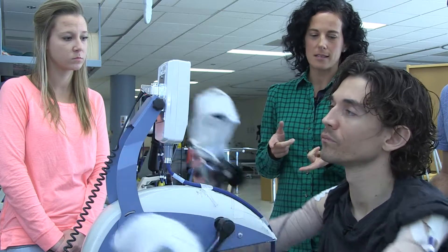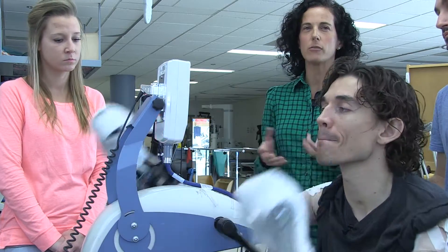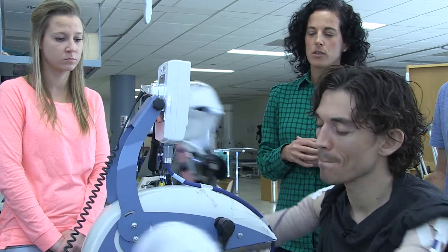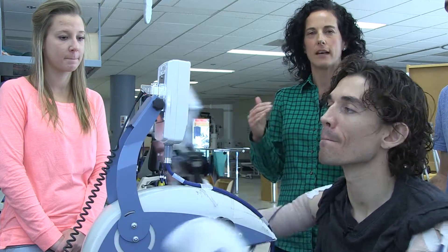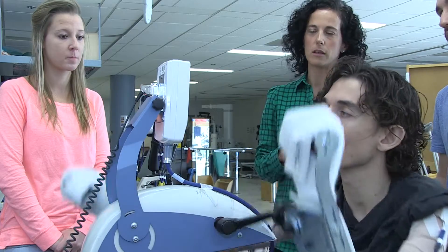For people who initially start out, their muscles are quite weak, so even with the stimulation the contraction probably isn't strong enough to power the machine themselves. The machine helps out a bit, and as their muscles get better at contracting with the stimulation, the machine backs off and lets them get a really good workout on their own, or with just a little help.